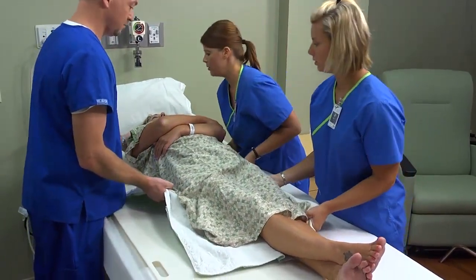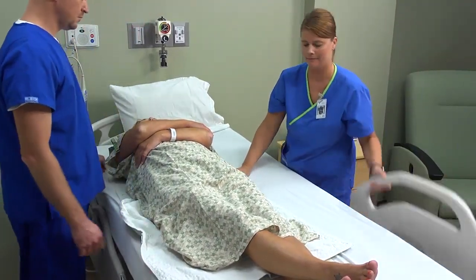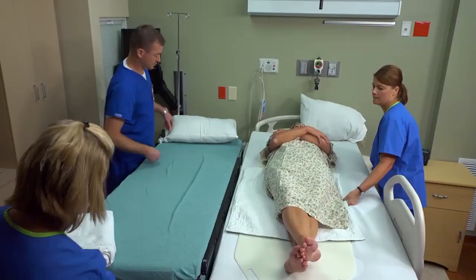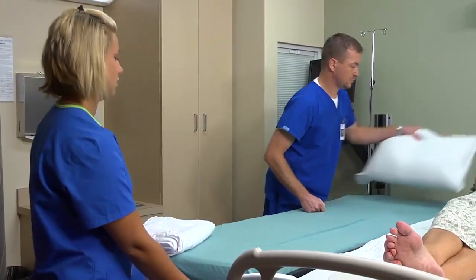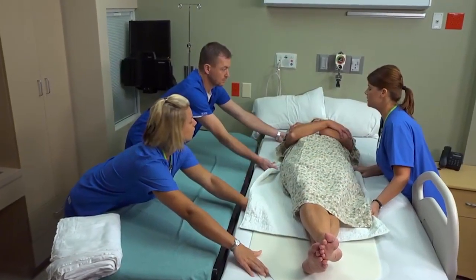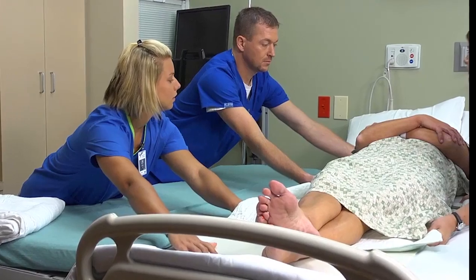Slip the slide board under the waterproof pad. Then gently roll the patient back onto the slide board. Adjust her position to center her weight on the board. Now line up the stretcher with the bed and lock the brakes on the stretcher. Stand on the side of the bed without the stretcher. Make sure the other 2 assistants are positioned on the opposite side of the stretcher. If you like, position an additional assistant at the head of the bed to support the patient's head and neck.